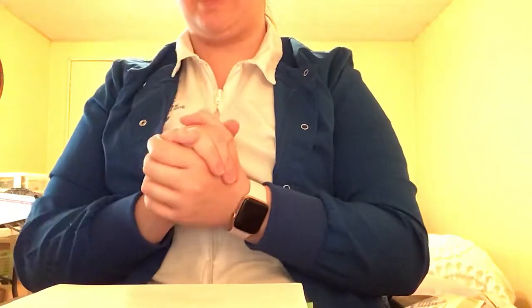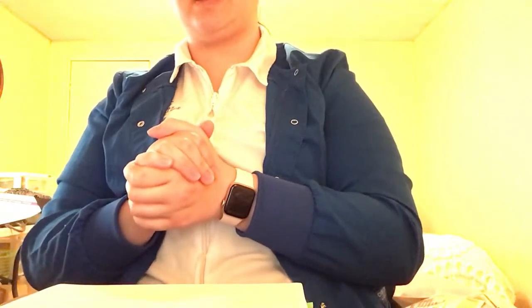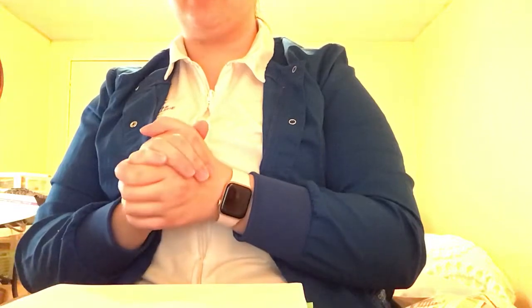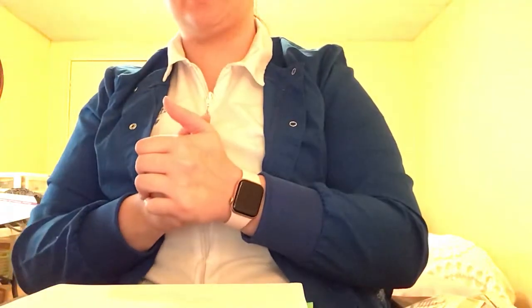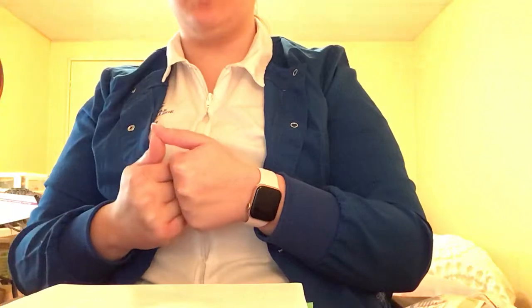And I would let her know that, Anna, I'm here to give you 2 injections today. I'm here to give you your monthly B12 injection, which you should be getting once a month. And I'm also here to give you your influenza vaccine, which is given once a year. Do you have an allergy to eggs? I would ask her, and she would say no. And I would say, because people who get the influenza vaccine, if they're sensitive to eggs, they may have a reaction to the influenza vaccine.